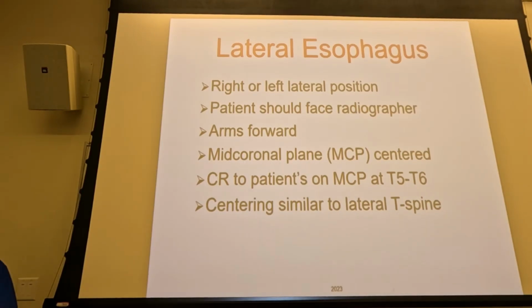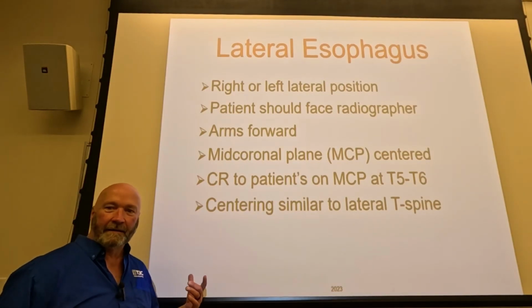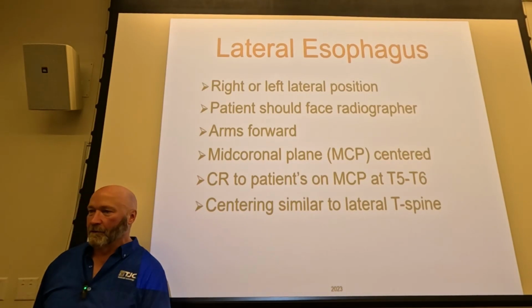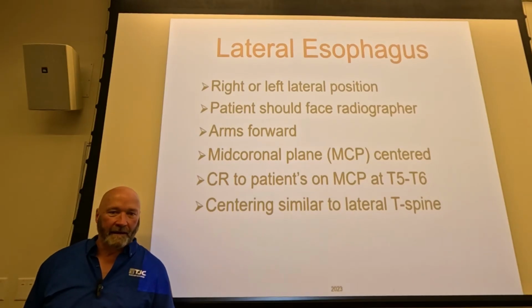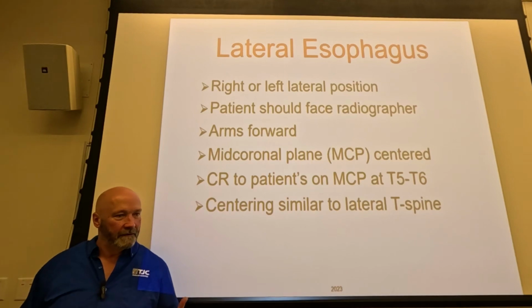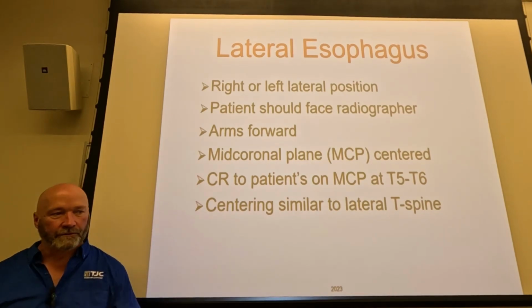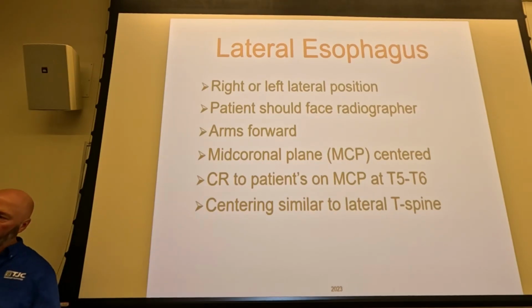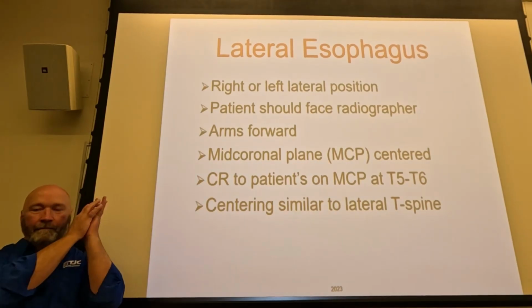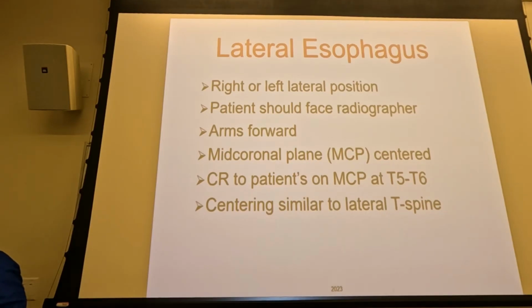Be specific in your instructions. You just had the patient with the arm down to their side. It's natural that you might roll them up onto their side and they think, I gotta keep this arm down like this, right? Well, if you do, you're gonna have an arm over your esophagus, so make sure that you tell them to put their arms out in front of them. Most of the time, you can tell them to put them out like you're praying, right? And they kind of know what you're talking about.